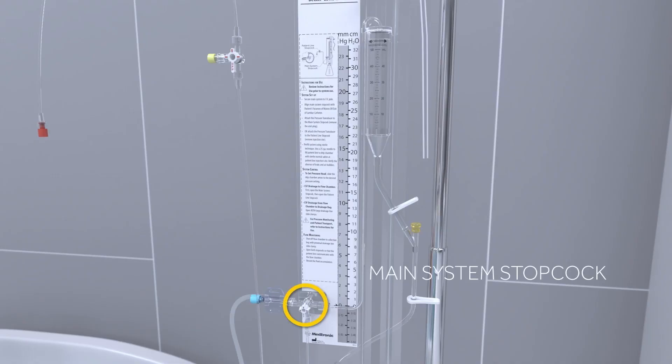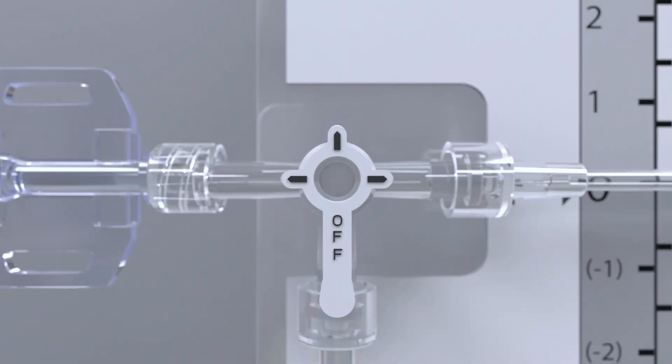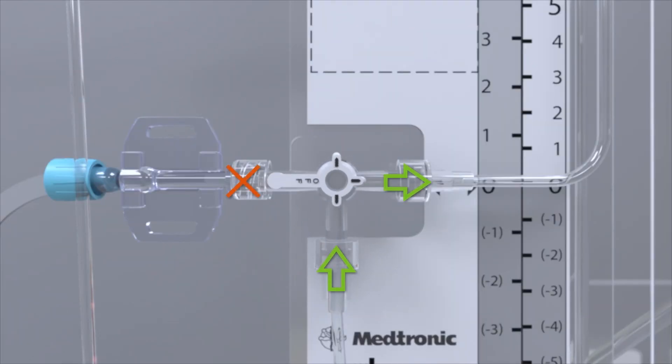The main system stopcock controls flow from the patient line stopcock to the transducer adapter or dead-end plug and into the drip chamber. Like the patient line stopcock, the main system stopcock is marked with three arrows, as well as an arm marked with the word OFF. The arrows indicate the directions which fluid can flow, while the OFF arm indicates where the fluid cannot flow.